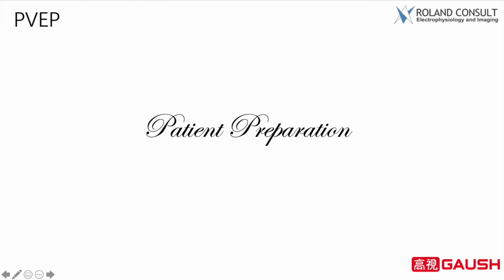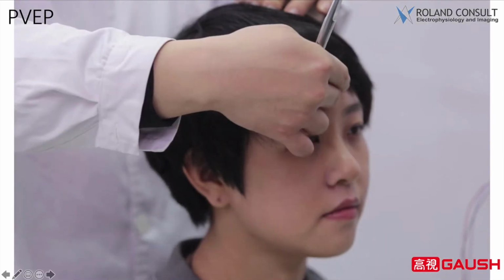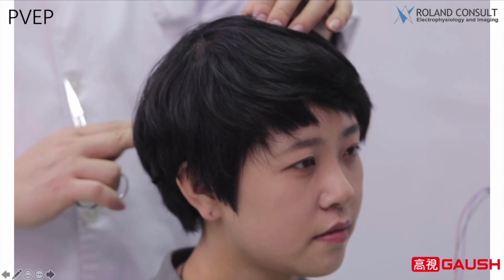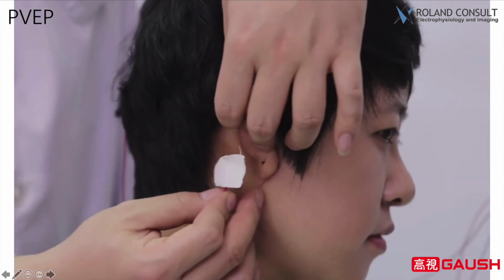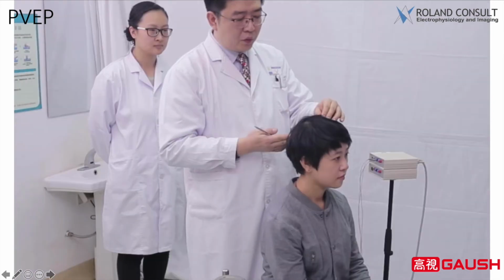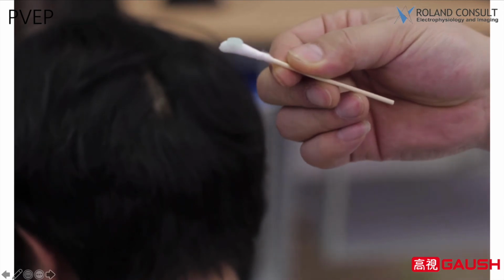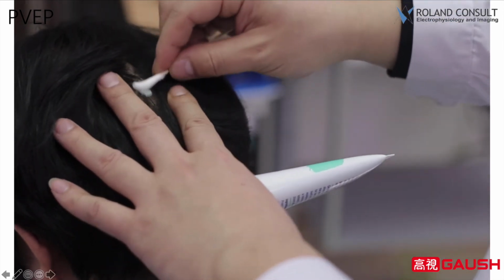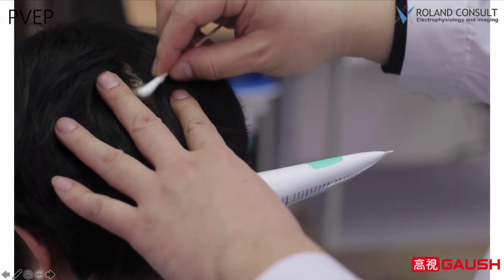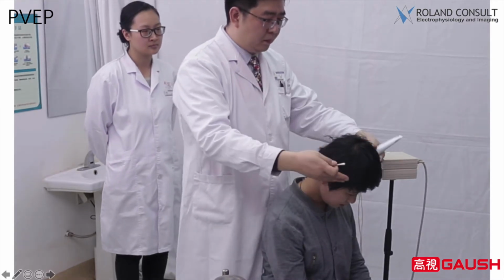Patient preparation. Step 1. Clean the skin. Use a special skin cleanser to clean the skin where the electrode is to be placed, and wipe vigorously to remove oil from the skin surface. If possible, ask the patient to have his hair washed on the same day and tell him not to use cosmetics.